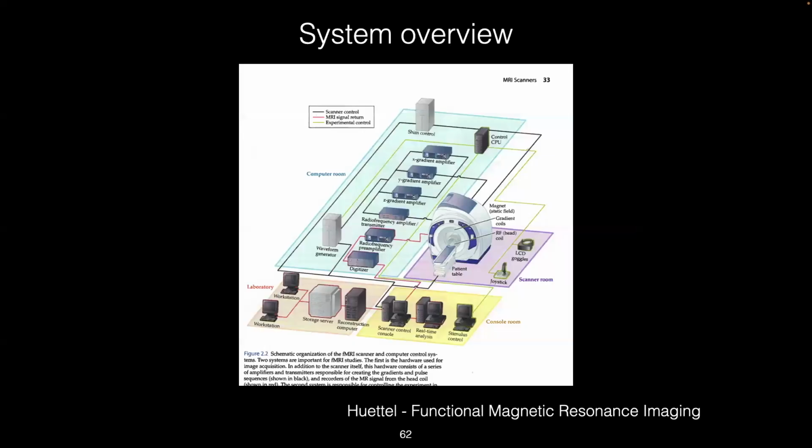And then finally, I'll just give this one last overview of how systems are typically set up. If you haven't seen this, hopefully you have by now. But there is an MR magnet, and this is a bed where a patient or sample would go onto and go into here for imaging.